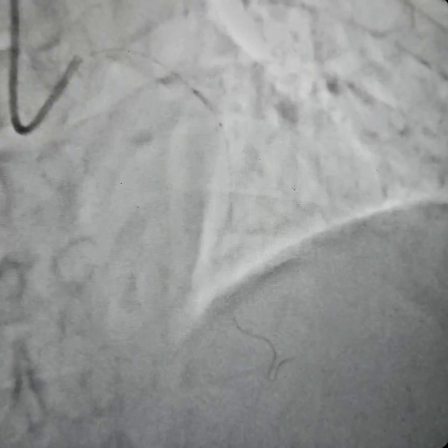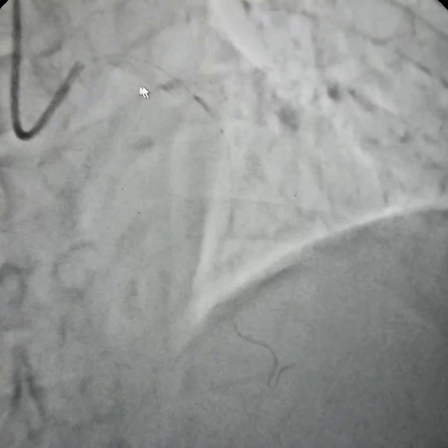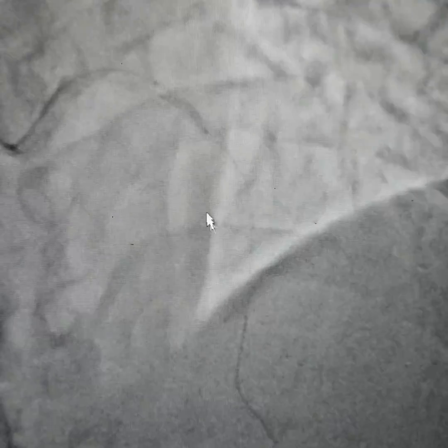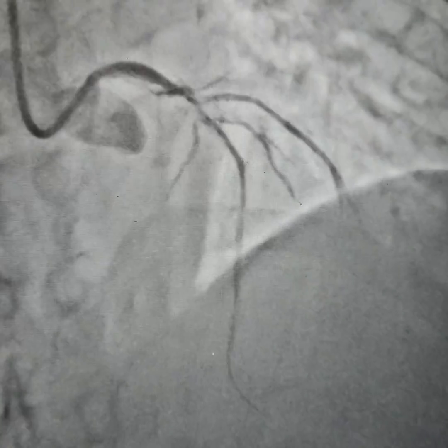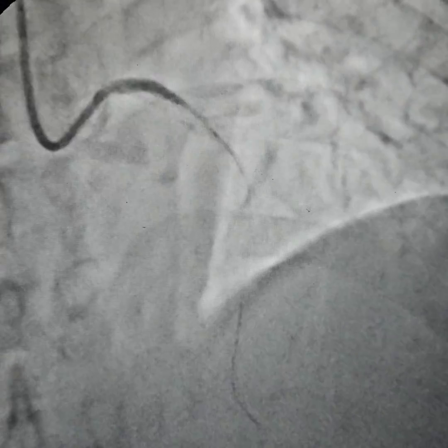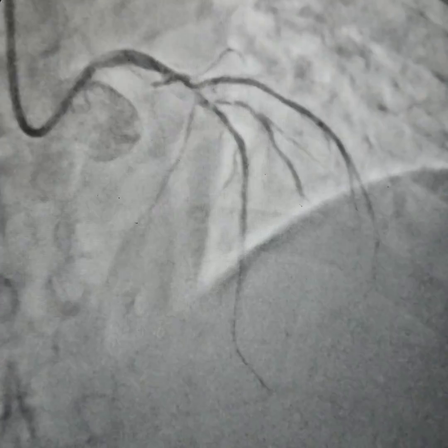Diffusely narrow LAD segment. Pre-dilation on the way — you can see a lot of calcium here. Again some more pre-dilation. This is a 2x10 balloon, but the 2x10 balloon is not able to do much.